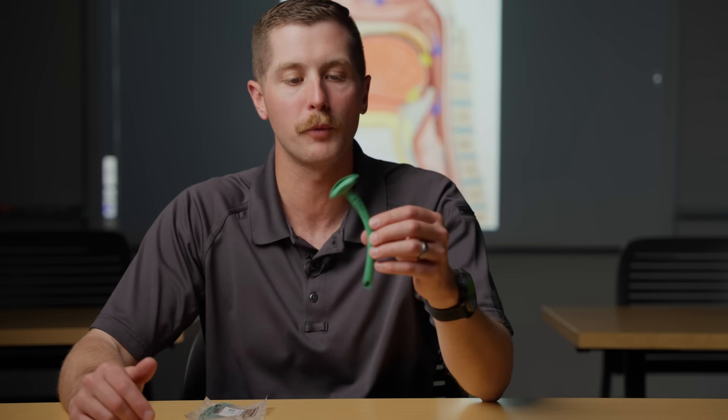In this week's video, I'm going to go through this device, how to measure it, when you're going to use it, when you're not going to use it, and then finally how to insert it in a real patient.